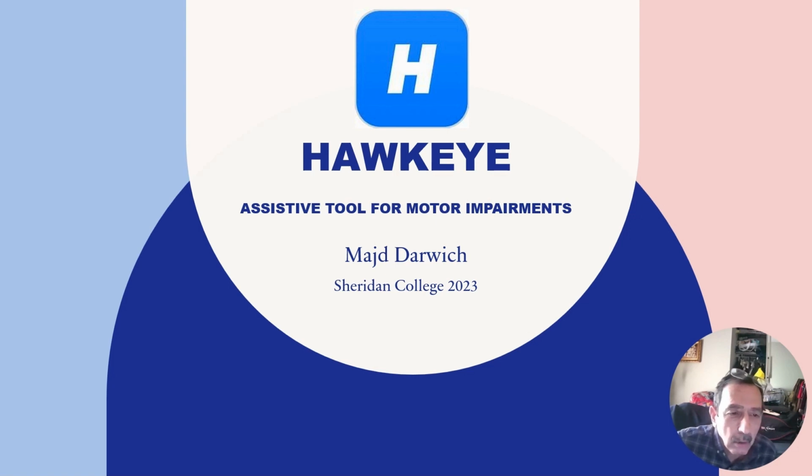Today I'm going to talk about an assistive tool for motor impairment, which is HawkEye.